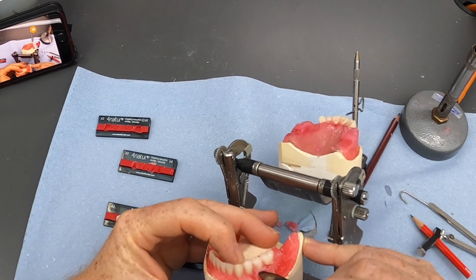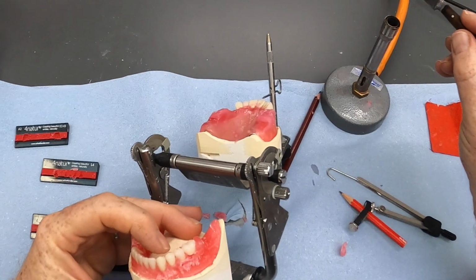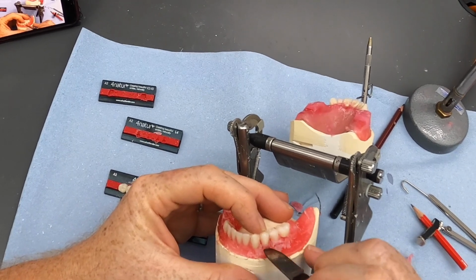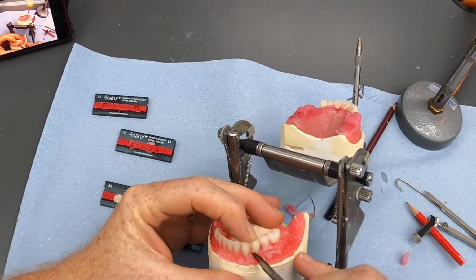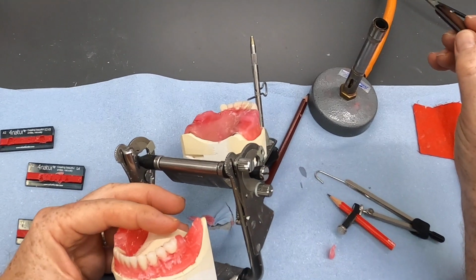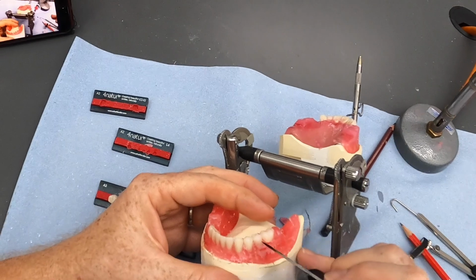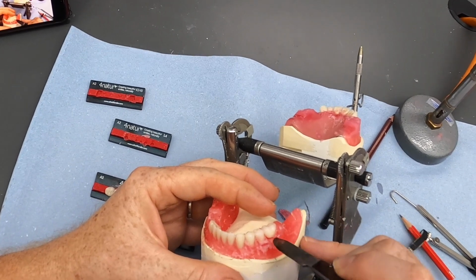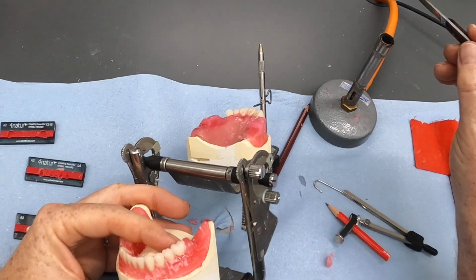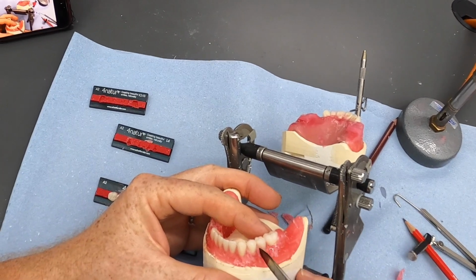Like so. Now, what we want to do at this point is make sure we can get the upper 6 into position, and that it's going to occlude nicely when we go into lateral and protrusive excursions, and adjust our teeth accordingly to make sure that we're going to get contact.